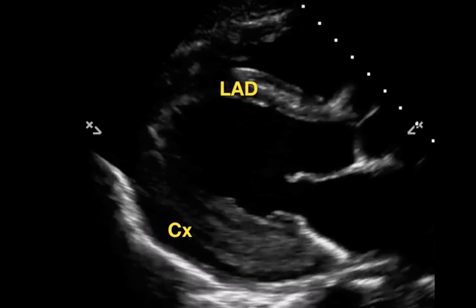When assessing the left ventricle, you can also watch for wall motion abnormalities. The interventricular septum is supplied by the left anterior descending coronary artery, and the posterior wall is supplied by the left circumflex. If any wall motion abnormalities arise, you can estimate where the lesion might be. Wall motion abnormalities present with a lack of or decrease of wall motion.